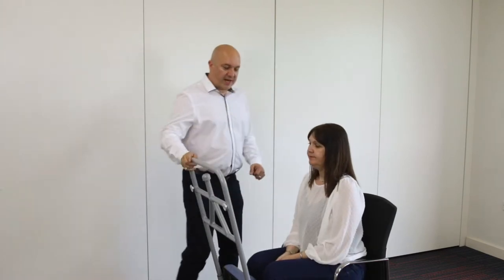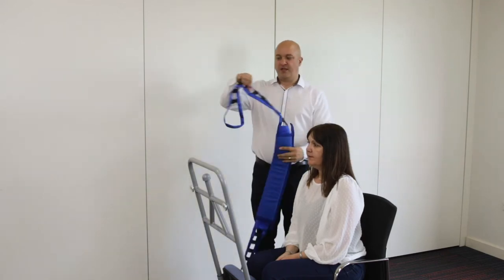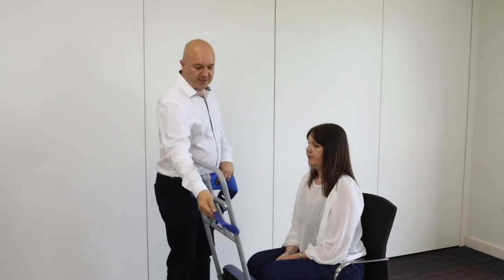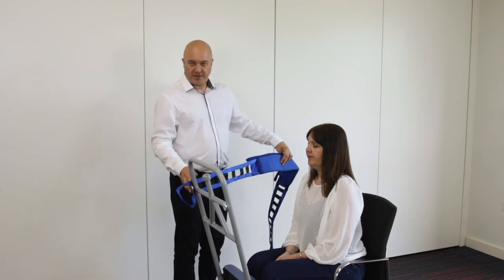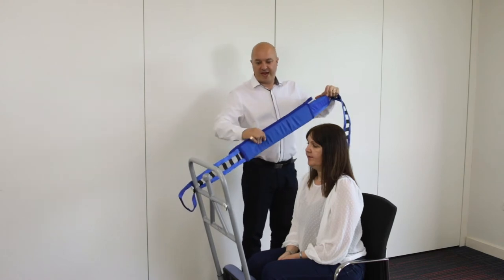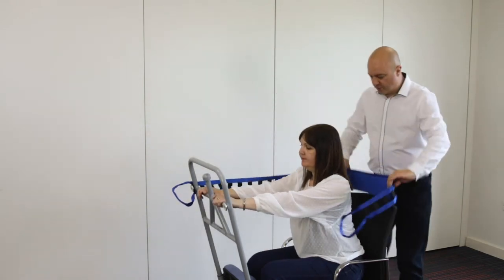If Sarah can't do that and needs a little more assistance, I'm going to get the ladder belt — the long blue belt, which looks a bit like a ladder. This will attach onto the silver discs at the back of the unit. I'm going to attach it on the left-hand side, and the sleeve on top will come around and behind Sarah's bottom.